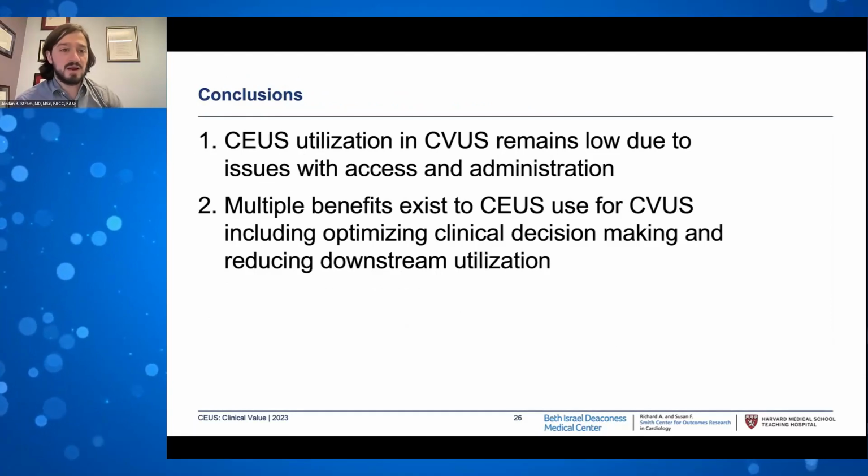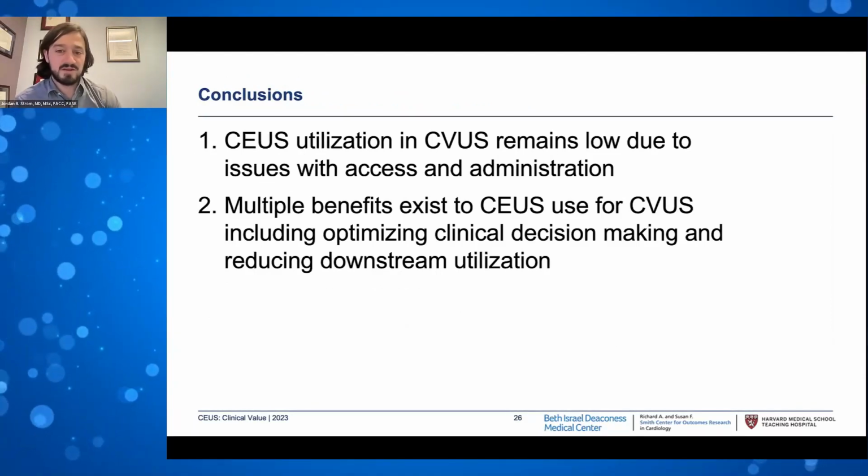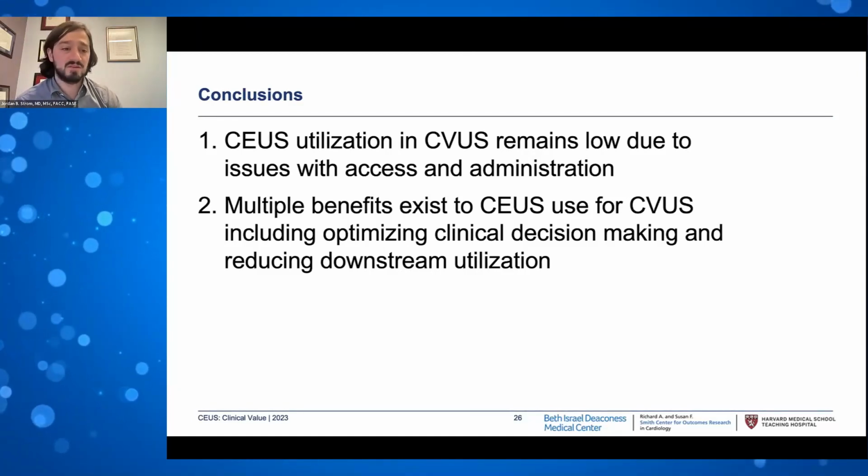So in conclusion, contrast-enhanced ultrasound remains underutilized for cardiovascular ultrasound, and it remains low in part due to issues with access as well as administration of these.